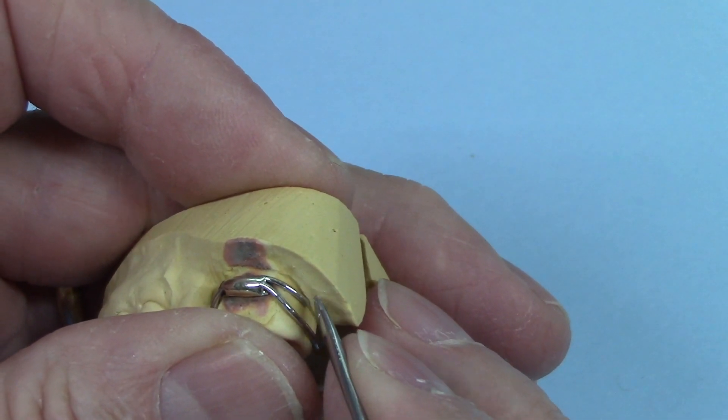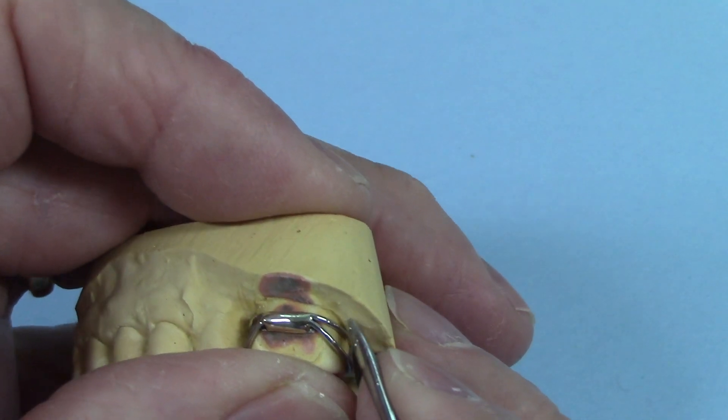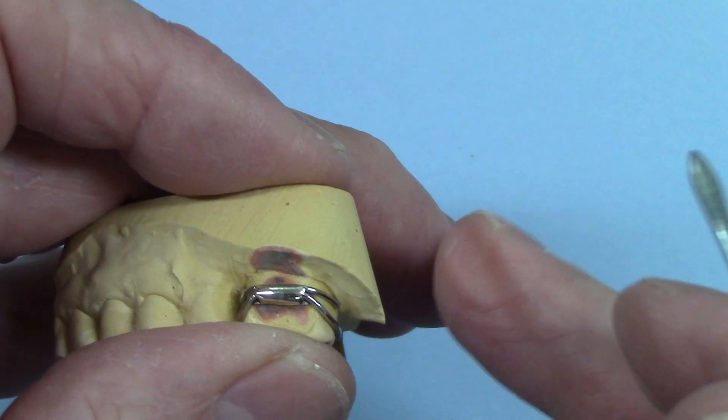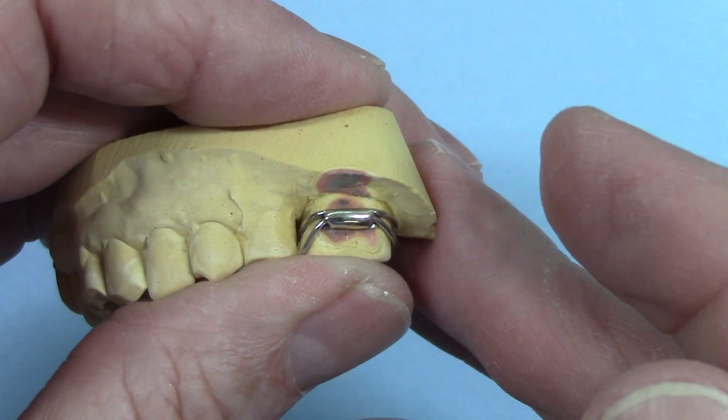But it doesn't need to be so soft that it doesn't have some elasticity to it. If this clasp were dead soft, these crescents would bend immediately and not have any retentive value, so it needs to have some elasticity to it. It's nice to have that cobalt alloy wire.